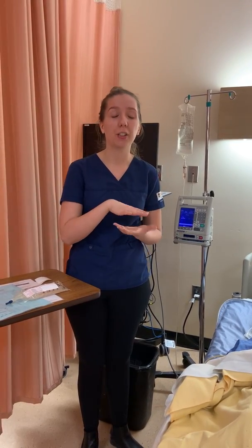I've already drawn blood for their initial APTT and CBC, and I will be continuing to monitor those levels and then titrating the dose depending on those results. So 6 hours from now is when I will draw a new APTT. In addition to monitoring that, I'm going to be monitoring my patient for any signs of bleeding. So I've already taken their vital signs and I will follow up, making sure I don't see a drop in blood pressure or an increase in heart rate.